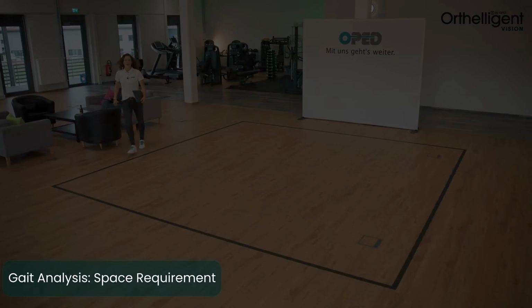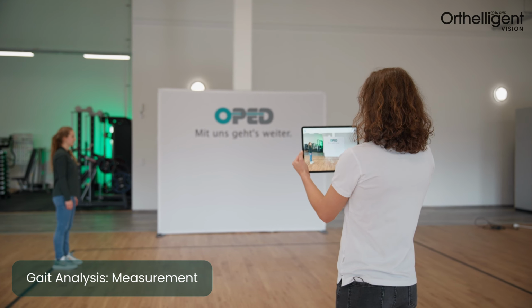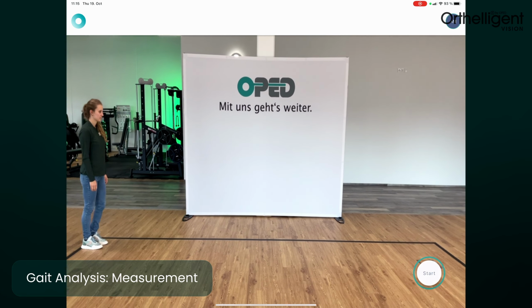You can add a new measurement by clicking on the plus symbol. Open the new measurement flow. Click Start Scan to begin the measurement. Turn the camera to the direction of the patient. Try to hold the tablet stable and don't swing it. By clicking on Start in the bottom right corner, you will begin measuring.